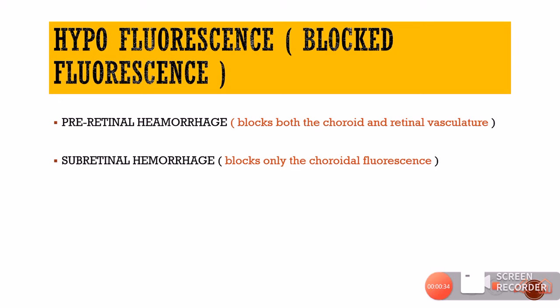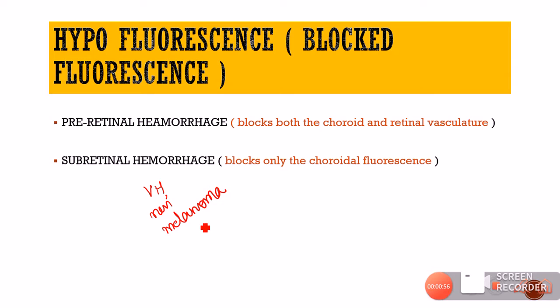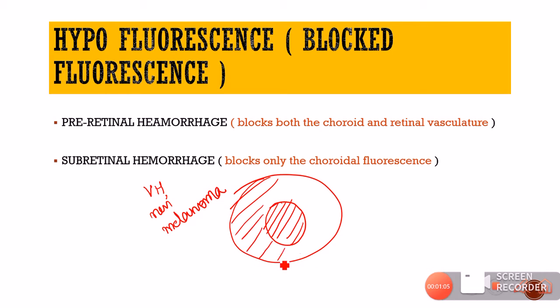Blockage of the retinal fluorescence can happen due to hemorrhages — it could be a pre-retinal hemorrhage, a sub-retinal hemorrhage, or even a vitreous hemorrhage. Blockage of the choroidal fluorescence can also occur whenever there is a lesion like a nevus or a melanoma. Such lesions are going to block the fluorescence and we are going to see a dark area in the fundus, surrounded by the normal fluorescence.